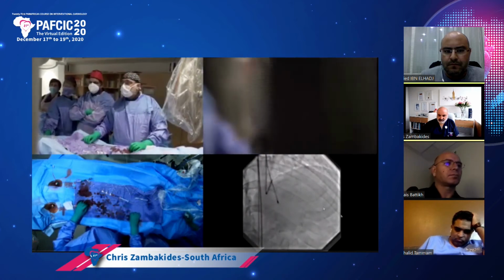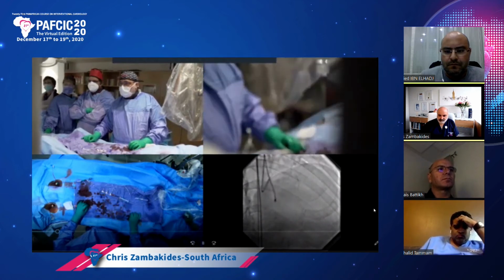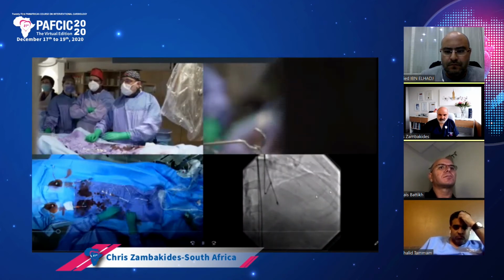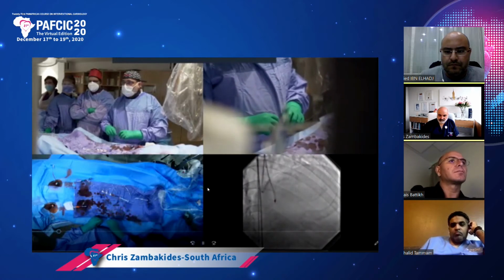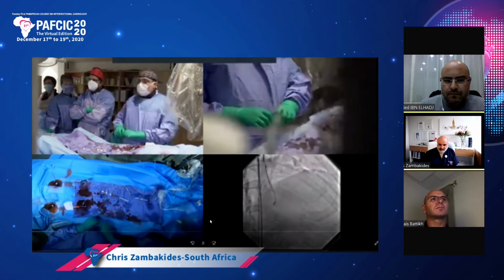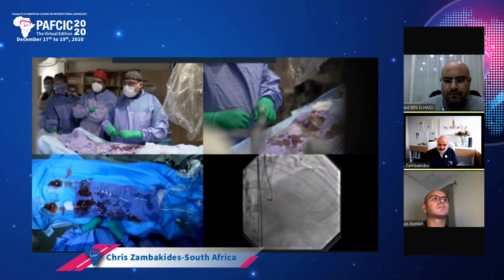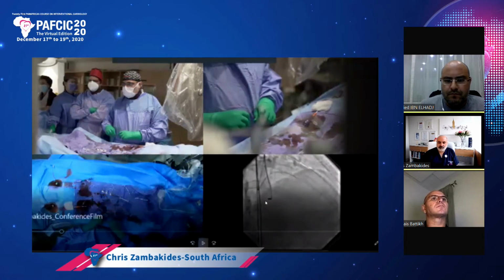Once you get into the septal, you want to advance your microcatheter that's at the septal, but you don't want to advance it too far down, because it'll then give too much support and your wire becomes like a needle and you're going to perforate. So you just put it in and support. This is what we call septal surfing, where we are just going to go down and see if we can find a communication. Just going to pause there.